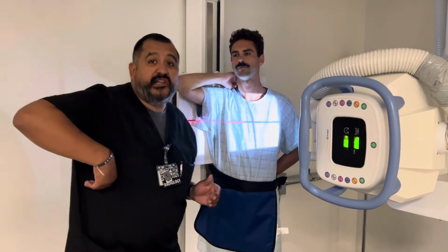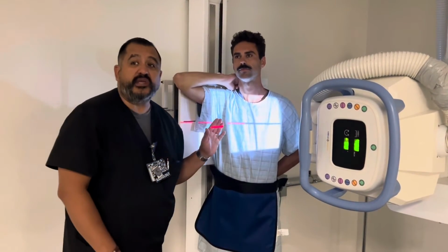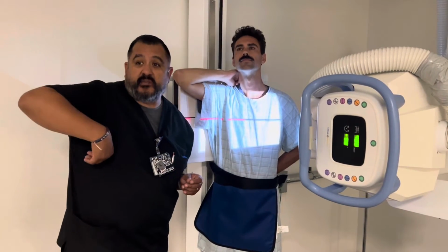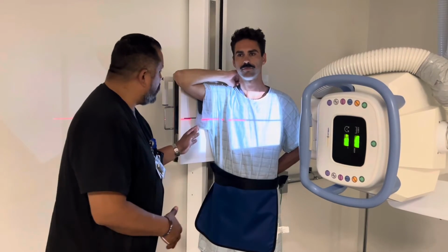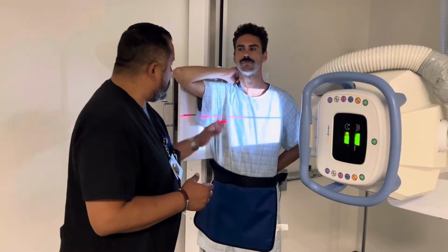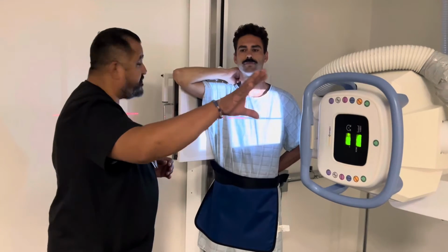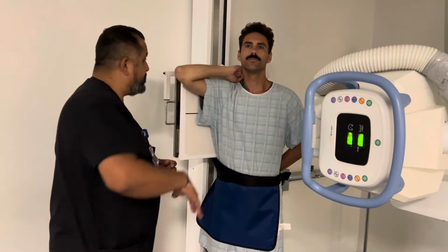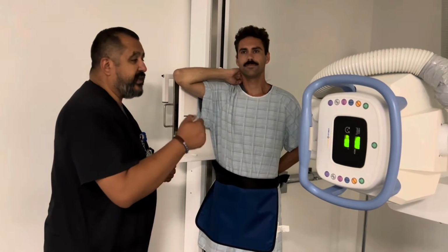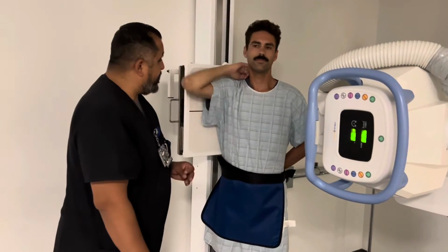If he had an axillary rib injury, you're going to do posterior obliques. So the RPO will be good for posterior rib injuries or axillary rib injuries, the ones that come along the side of the ribs. So now we're going to have them again. I have the technique set at about 14, 15 mAs. We're doing a little bit bigger body part now because it's turned at an angle. I'm going to have you go ahead and take a deep breath in, let out, take another deep breath in, and hold it, just like that. Okay, x-ray clear, beep, and this is going to be for the right posterior ribs, right? You can relax and breathe, all right?